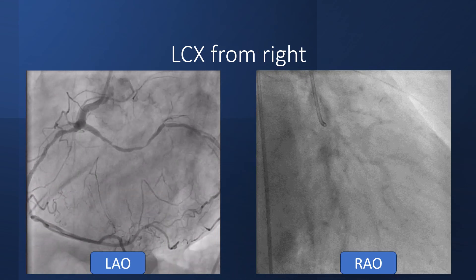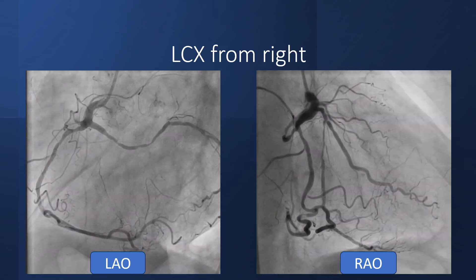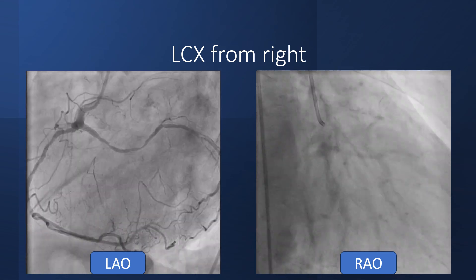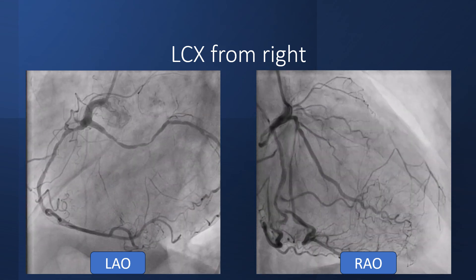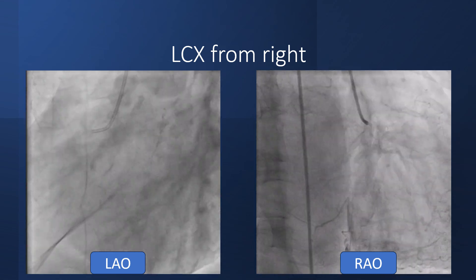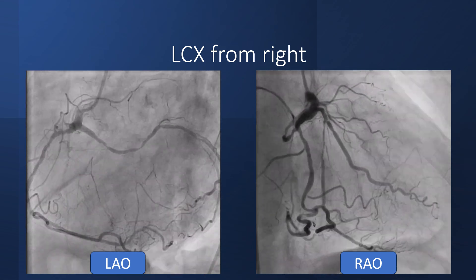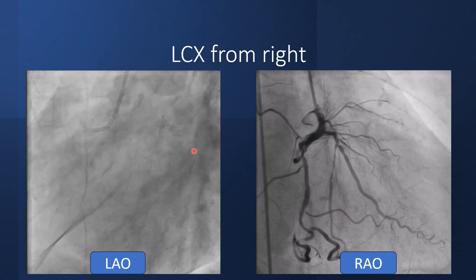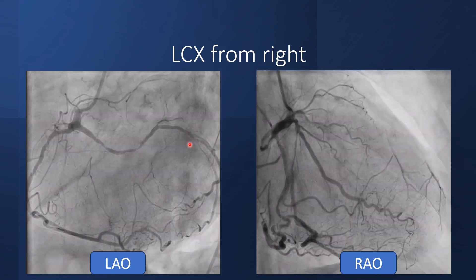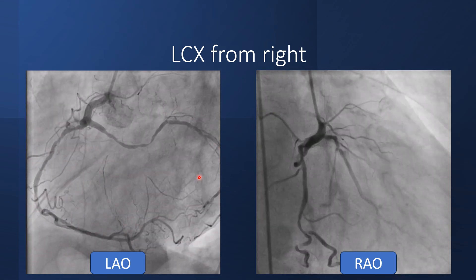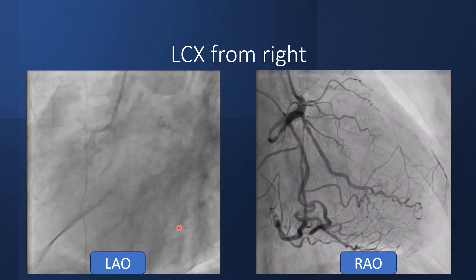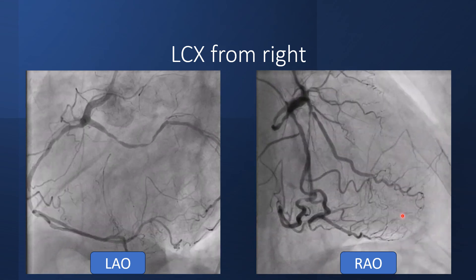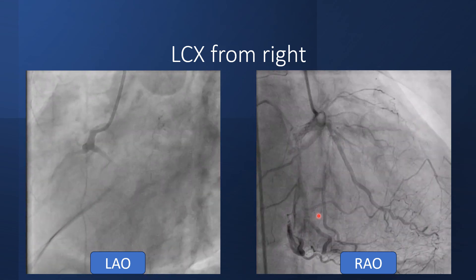Anomalous origin of the circumflex from the right is the most common anomaly and by itself is usually benign. In this patient, the circumflex arises from the proximal RCA and the patient has significant atherosclerosis. The LAO view shows the circumflex taking a long distance from the RCA to the posterolateral part, while in the RAO view, the circumflex overlaps with the RCA.